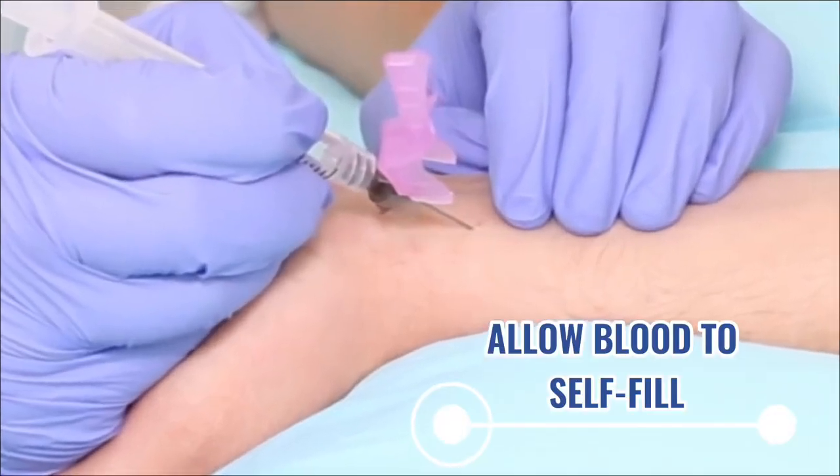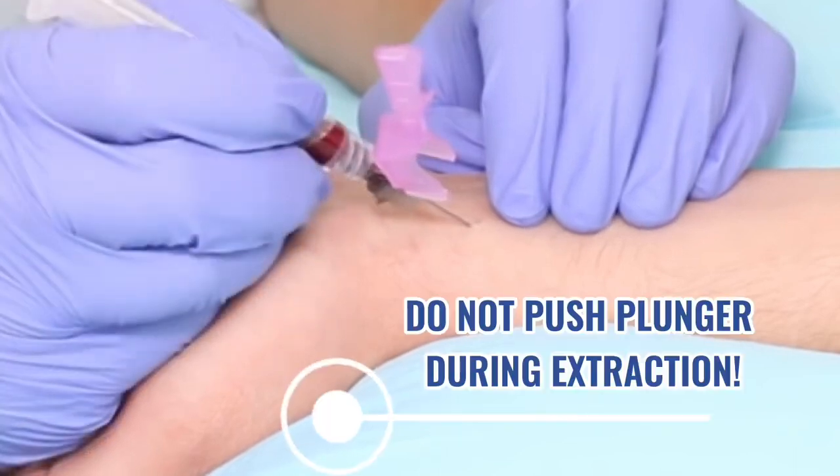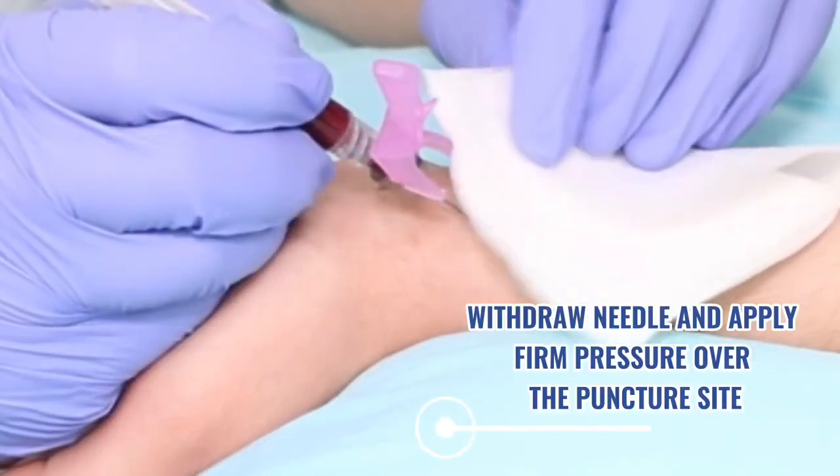Allow blood to fill the syringe automatically to the preset volume. Do not push the plunger during extraction. Once the syringe is filled, withdraw the needle completely.